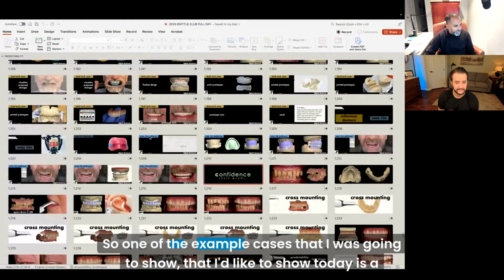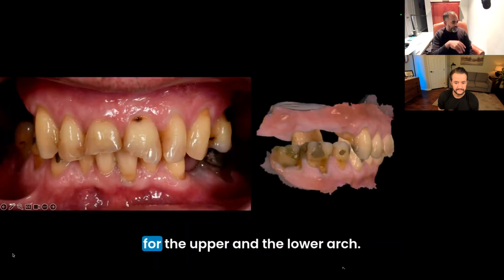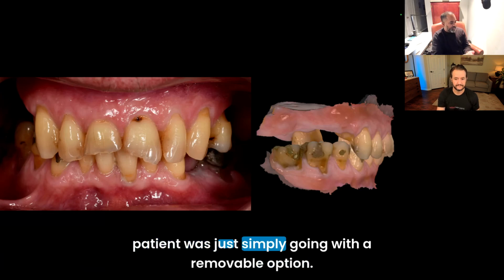So one of the example cases that I'd like to show today is a case where a patient is coming in, and the patient's going to need immediate dentures for the upper and the lower arch. In this particular case, it was because the patient was going to get full arch implant treatment for both arches, but this case can be handled exactly the same way if the patient was just simply going with a removable option.